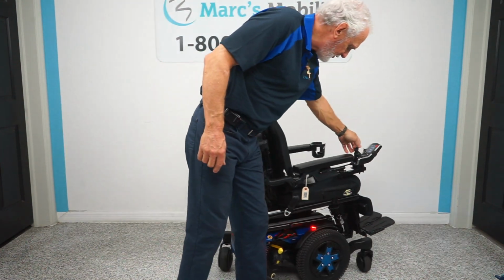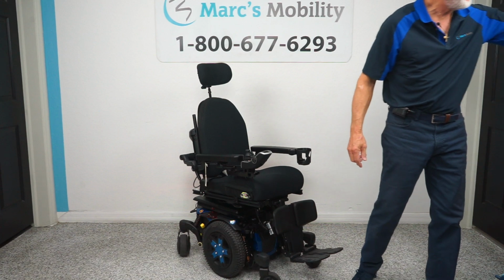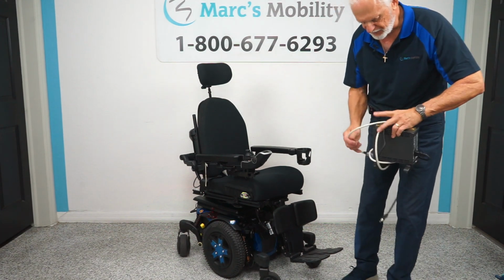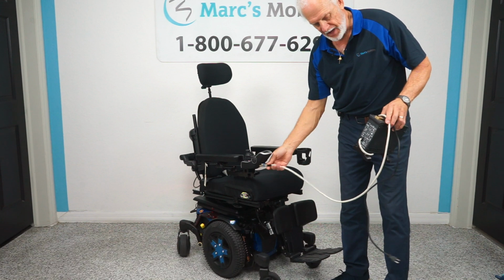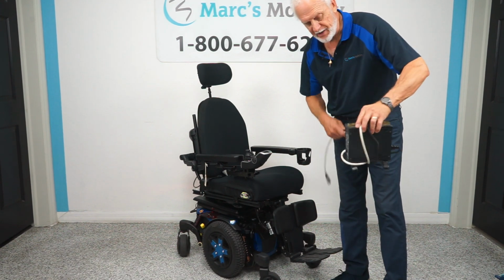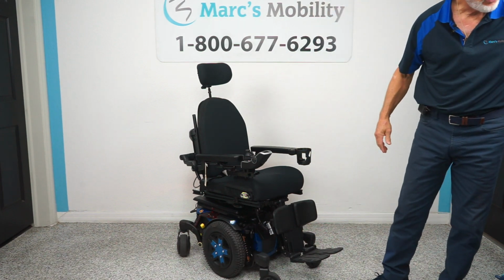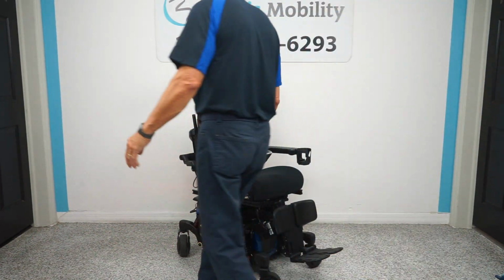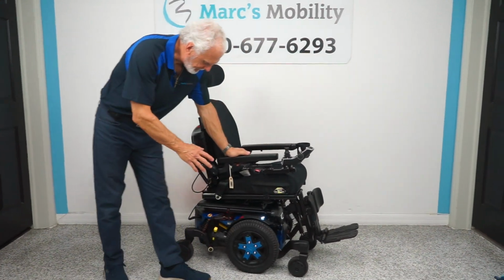When you charge the batteries in this chair, you'll take the charger that comes with the chair. This may not be the charger, but we'll use this one. Most chargers will plug right here in front of the chair, and as soon as the light goes from orange to green, the charger will recognize that the batteries are full and the charger will cut off. These are smart chargers. They will stop charging once the batteries are full. So let's go back to this chair.